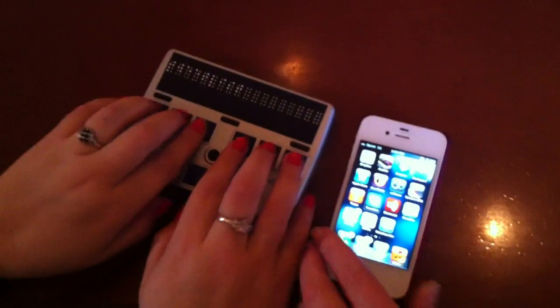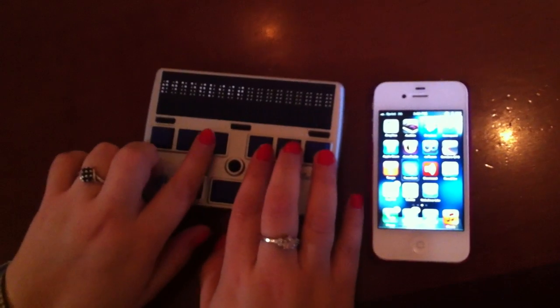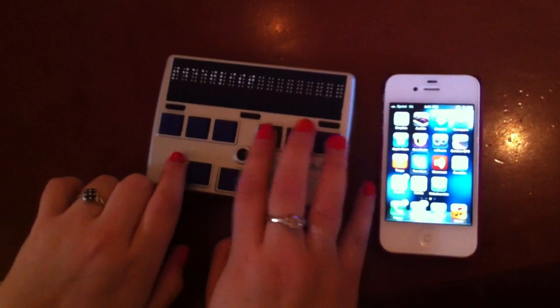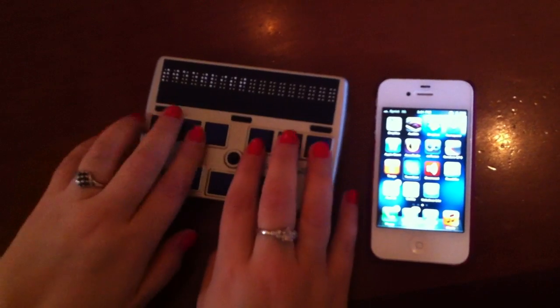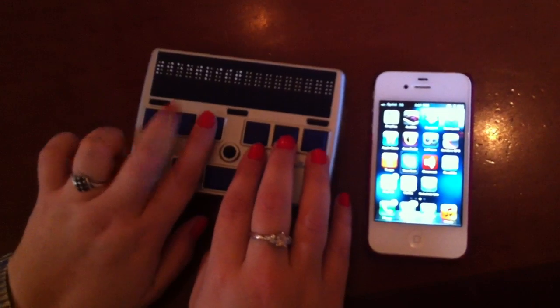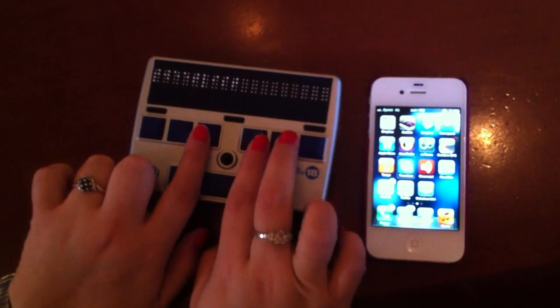All right. And so Braille is a combination of, each letter is made up of a combination of 6 dots. And so I have dots 1, 2, 3, 4, 5, 6 on here. And if I wanted to make an A, I'd press 1. If I wanted to make a B, it's dots 1 and 2. C is 1 and 4. D is 1, 4, 5. Okay, and so on. That would correspond to these little dots we see sticking up right here, right?